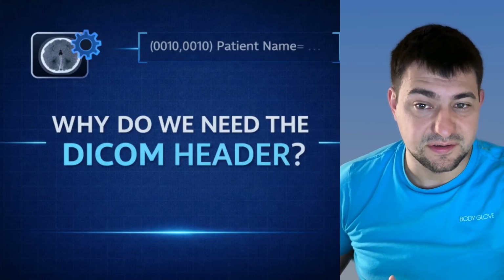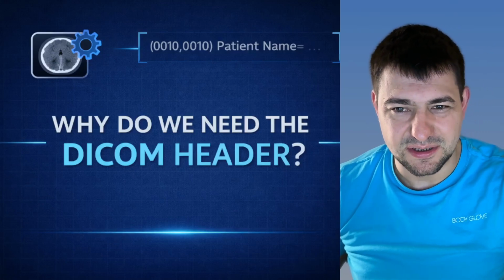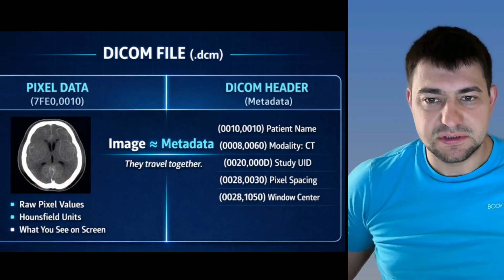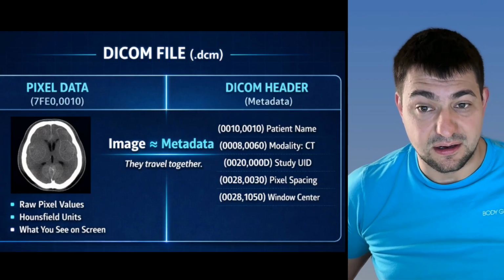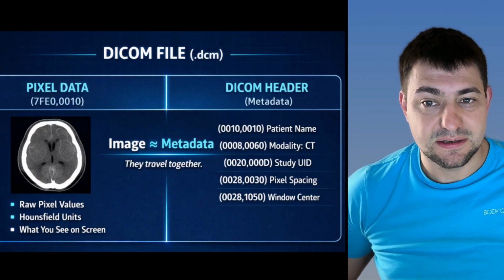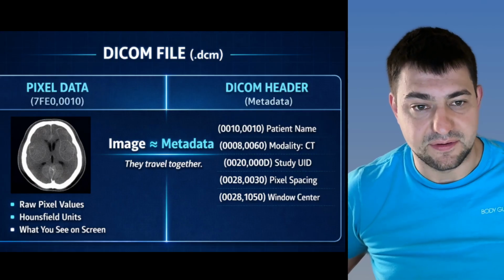You've heard the term DICOM header, but what is it and why do we need it? Let's try and figure it out. To understand this better, first we need to understand how a DICOM file, which in most cases is an image, is made, or what is it made up of, rather.